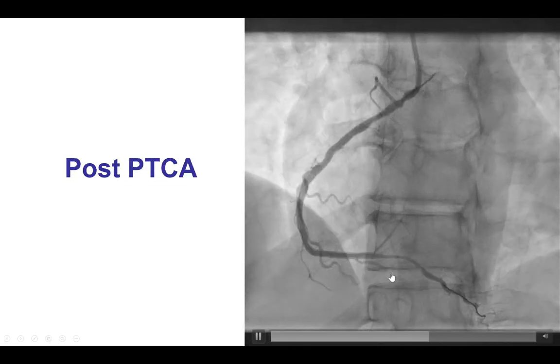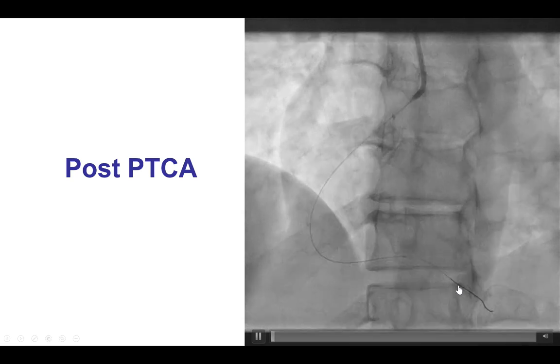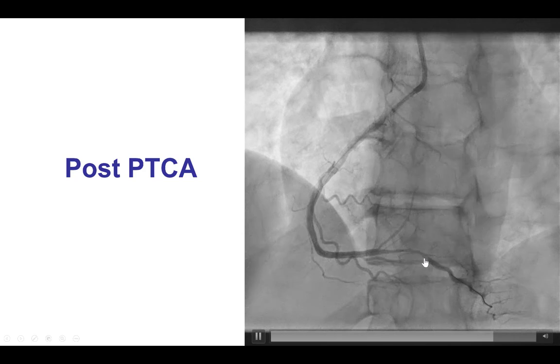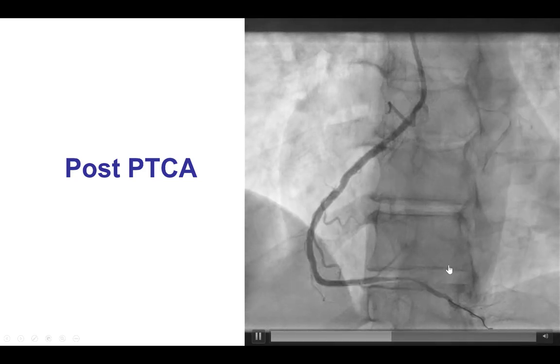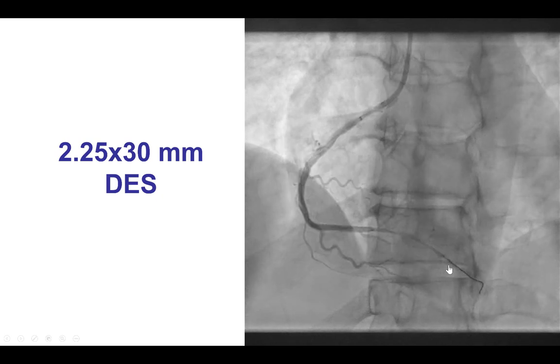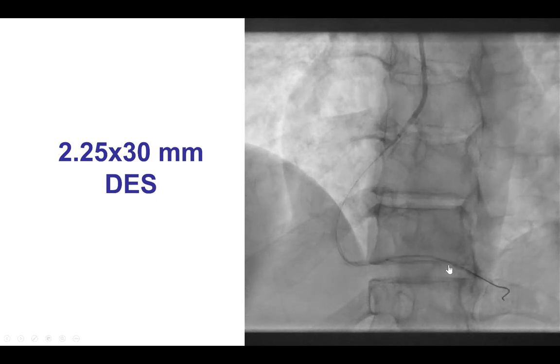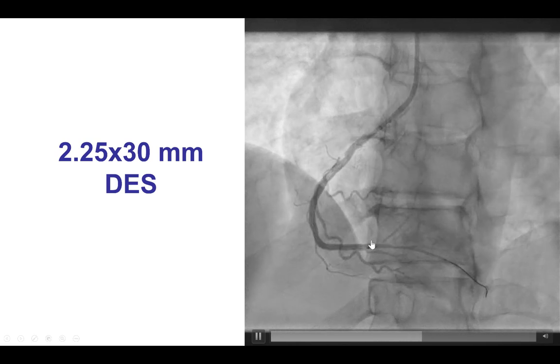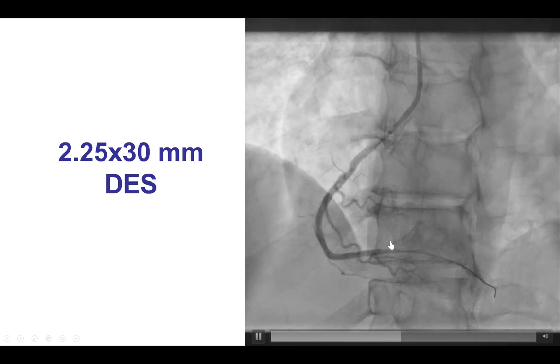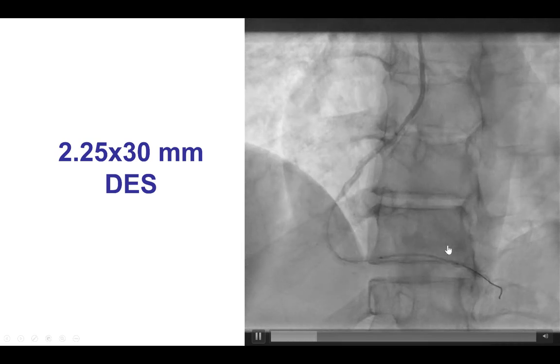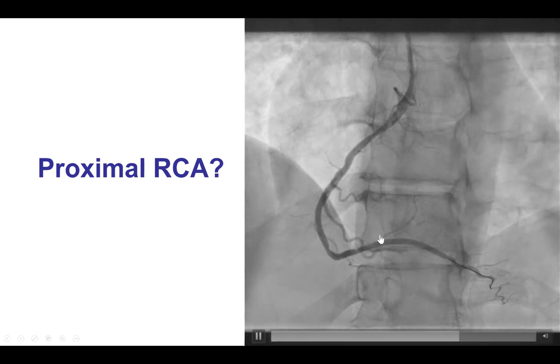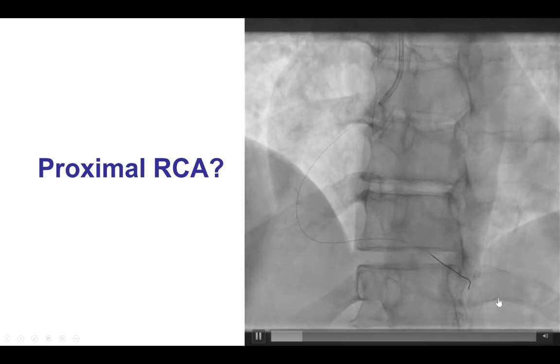Balloon angioplasty was done with a 2.0 mm balloon, and this actually restored TIMI flow to the PDA, demonstrating the area where the dissection was likely present. We then placed a long 2.25 by 30 mm drug-eluting stent. It is important to cover both edges of the dissection to minimize milking and pushing the hematoma either proximally or distally. That provided a nice result with TIMI flow in the PDA.